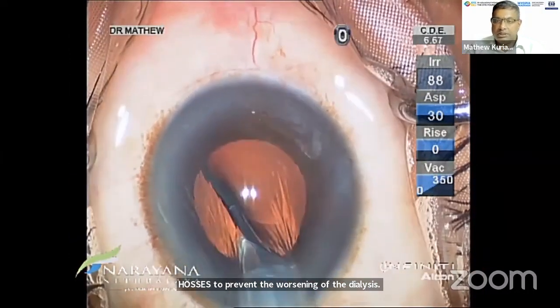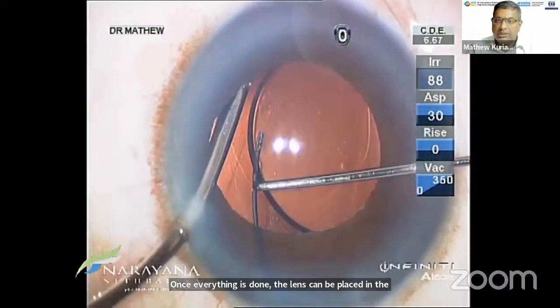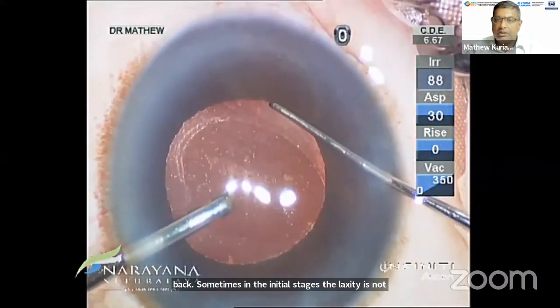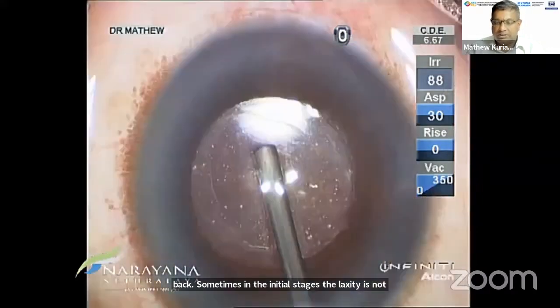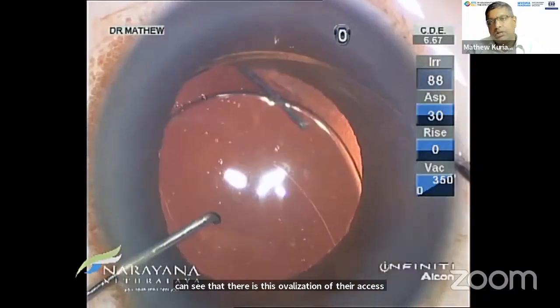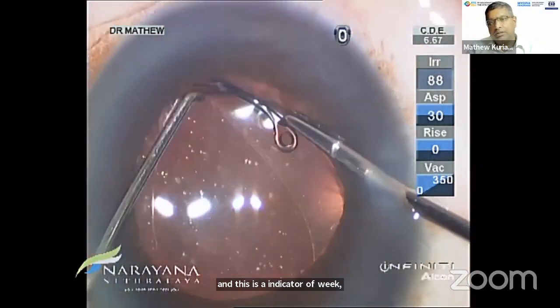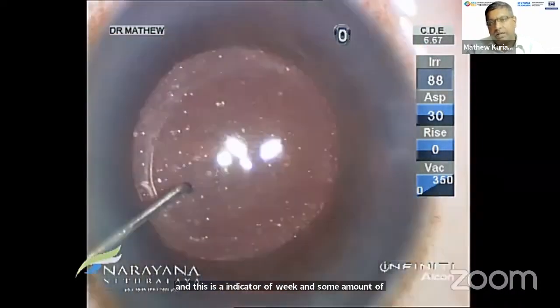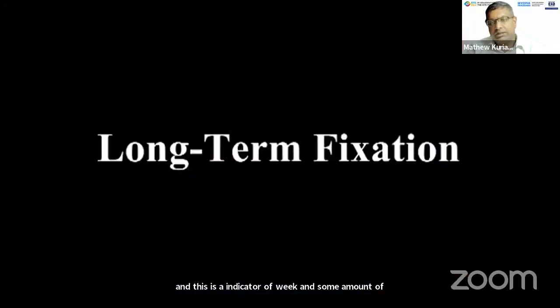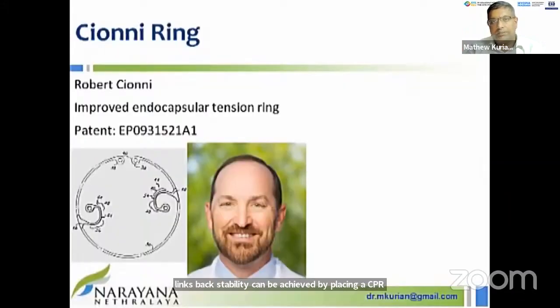Sometimes in the initial stages, the laxity is not so obvious, but on placing the lens inside the bag, you can see that there is this ovalization of the rexus, and this is an indicator of weak zonules, and some amount of lens bag stability can be achieved by placing a CTR late, and you can see the round rexus there.